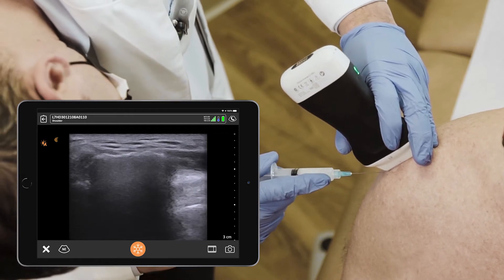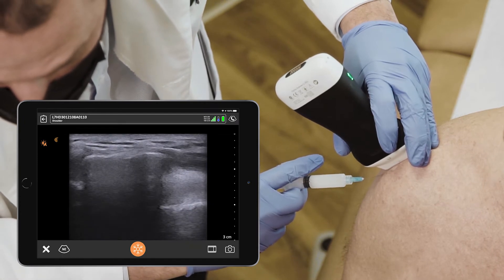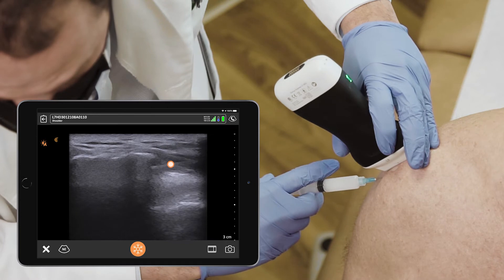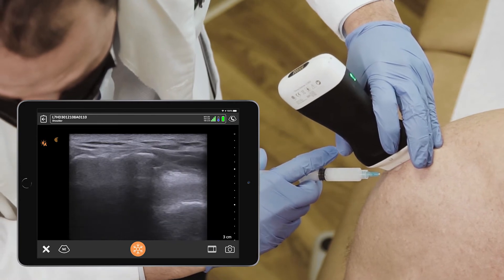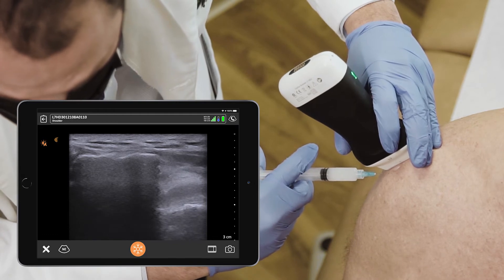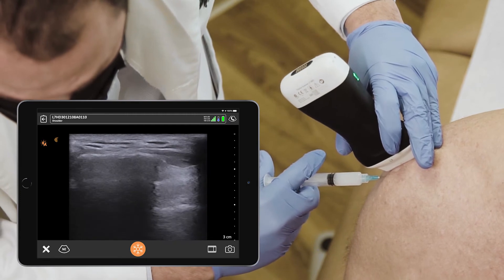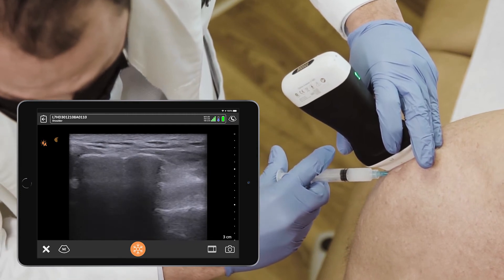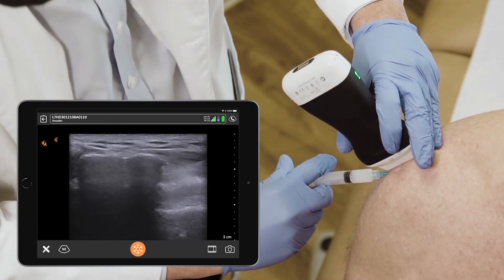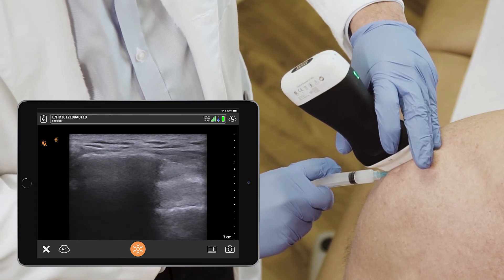A little pinch. There's a needle coming in under the acromion, and the injection should be smooth. The needle slides under the acromion, into the space above the supraspinatus tendon, to deposit the anesthesia and steroid.